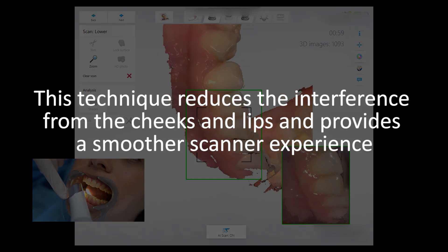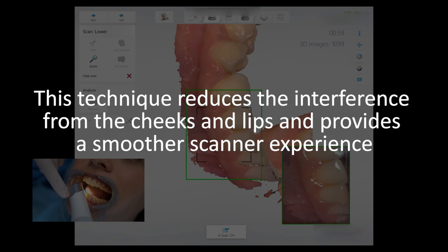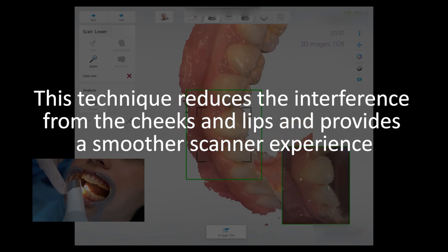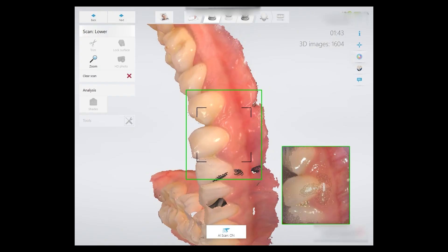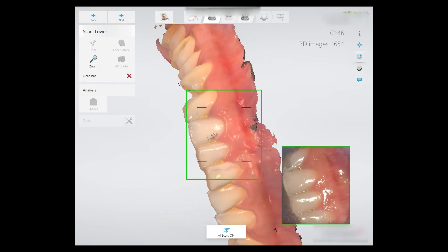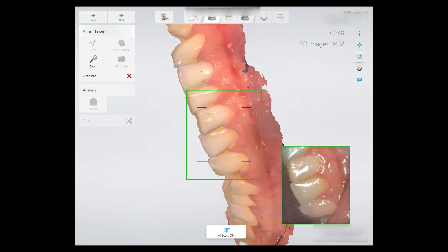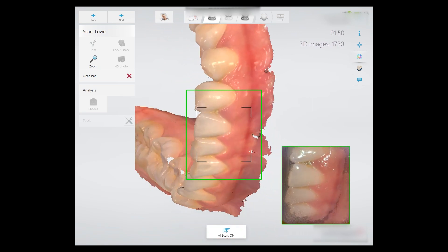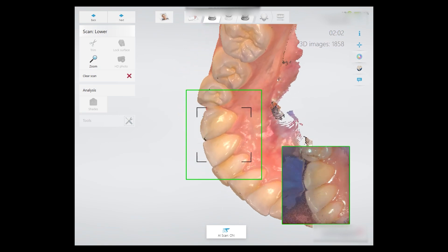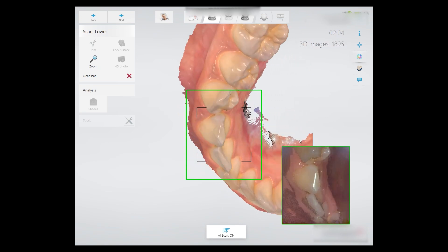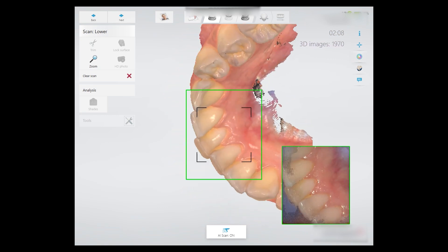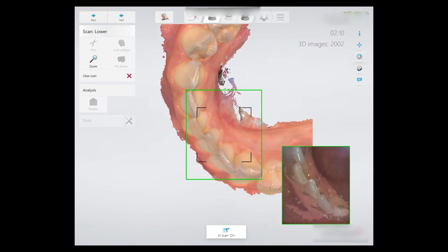This technique reduces the interference from the cheeks and lips and provides a smoother scanning experience. Once the buccal surface is captured, the incisal anatomy of the anteriors is scanned by placing the scanner tip lingually behind the cuspid and lateral, and rolling from the lingual surface to the incisal edge to the buccal surface. Repeat on the contralateral side.